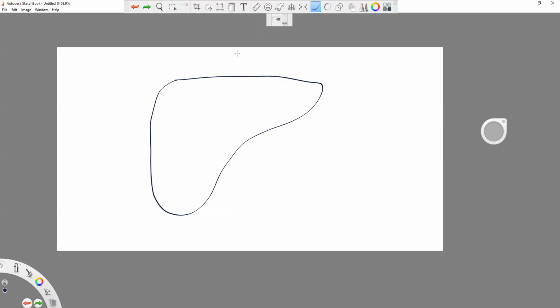What's also right here is a heart. We're only seeing a little bit of the heart, obviously, and this is the right atrium, right ventricle. Heart really lays on its side, not up and down like sometimes you think it is.